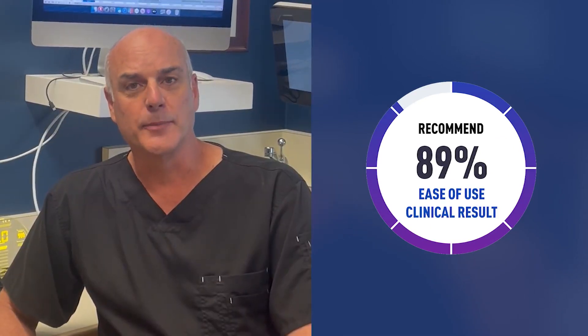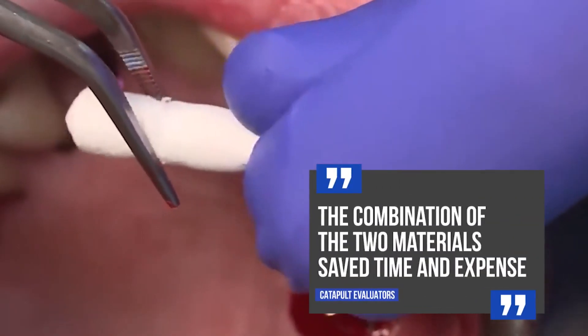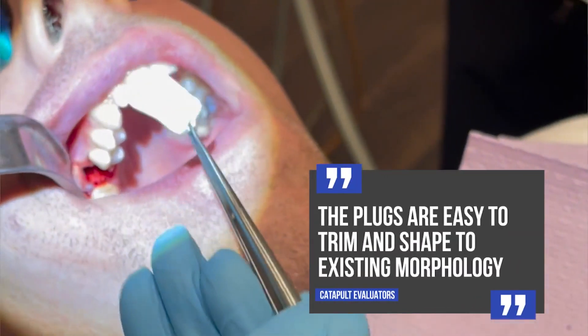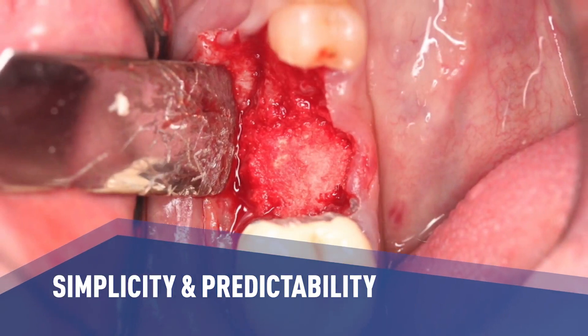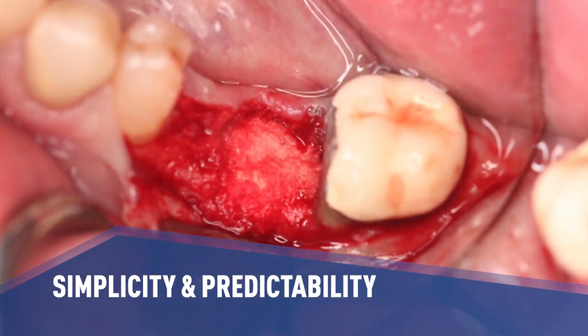Catapult evaluators like the combination of the two materials, which saves time and expense when socket grafting. Evaluators also like that the plugs are easy to trim and shape to the existing morphology. I found that Osteogen Plugs work better than other grafting solutions because of the simplicity of their placement and predictability of the results.